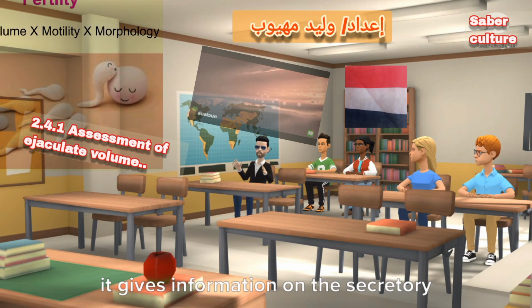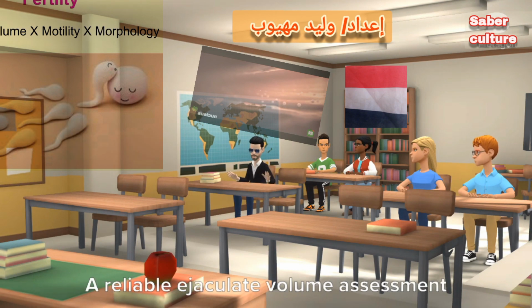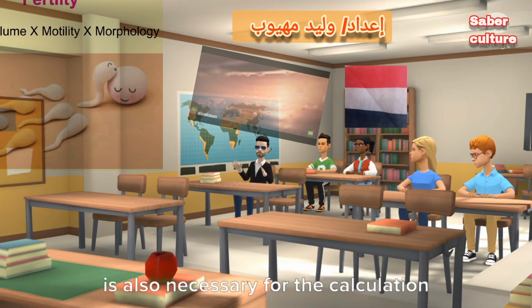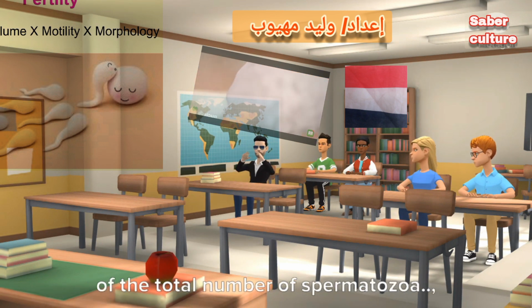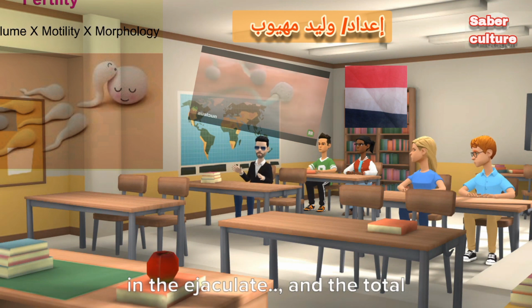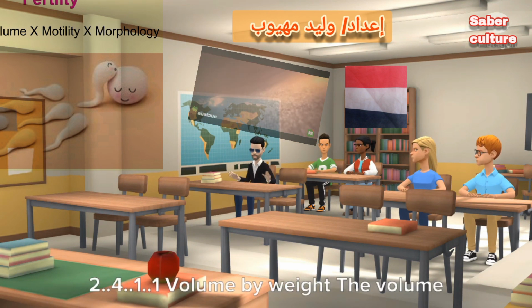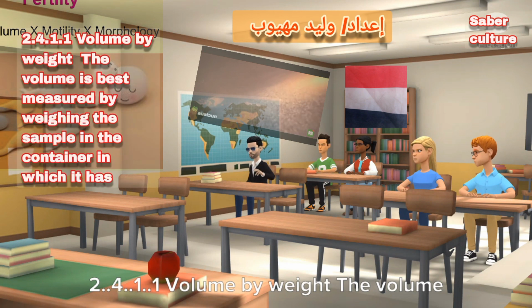Precise measurement of volume is essential in any evaluation of ejaculate because it gives information on the secretory functions of the accessory sex glands. A reliable ejaculate volume assessment is also necessary for the calculation of the total number of spermatozoa, the total number of non-sperm cells in the ejaculate, and the total amount of biochemical markers.